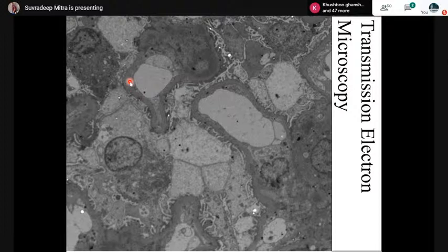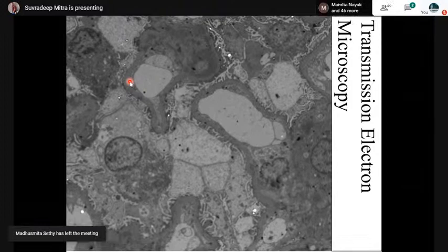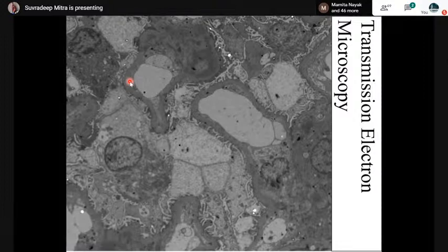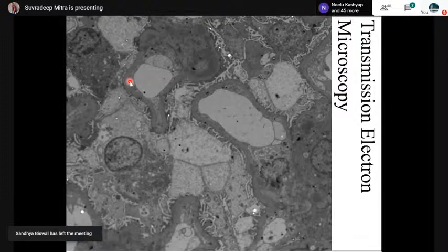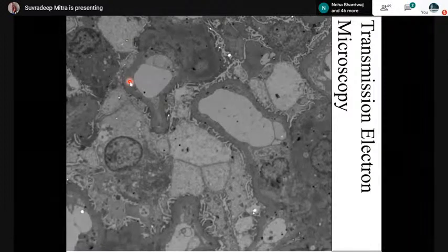Sometimes you are not sure about a diagnosis in terms of light microscopy or direct immunofluorescence. There are some renal diseases for which electron microscopy is a mandate, like thin basement membrane disease that I can remember. Also Alport syndrome: although immunofluorescence is available for Alport syndrome, looking at the transmission electron microscopy is really very helpful. Even in the immune complex deposition diseases, amyloidosis, and different organized deposition diseases, transmission electron microscopy is a real mandate. Sometimes, for example, if you have immunotactoid glomerulopathy or fibrillary glomerulopathy, without the electron microscopy you really cannot diagnose these cases.